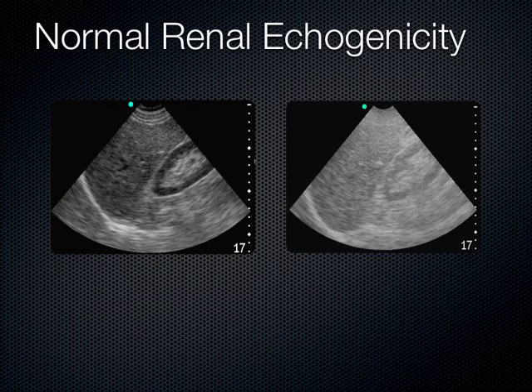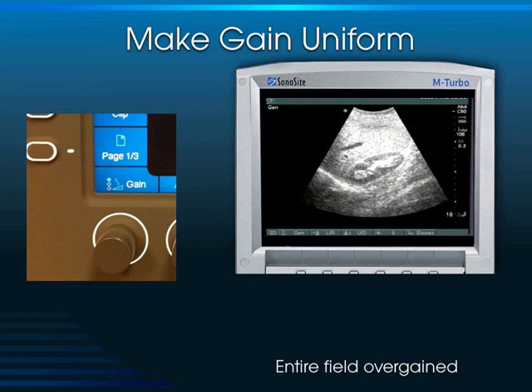Here's an image that's over-gained. As novices, we tend to want to over-gain the machine to see better. Also, when we're in a brightly lit room, the tendency is to turn up the gain — I see this a lot in my trauma bay. But you can wash out the image, making it really difficult to see how the cortex of the kidney is less echogenic than the liver.